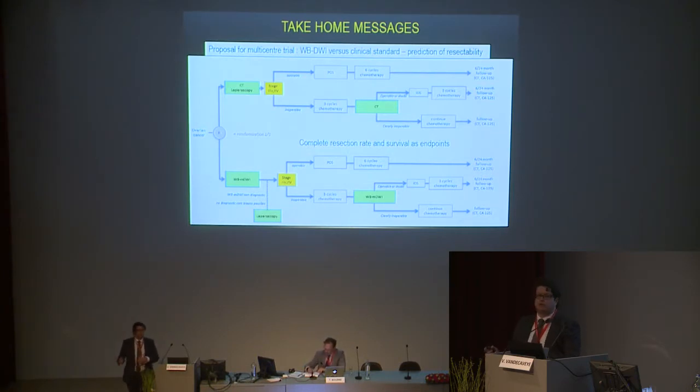But the Belgian government obliges us also to take into account overall survival, but I would doubt that we make a difference there. I think the most important is if we can improve or at least be, with a non-invasive technique, equally accurate to predict operability in these patients. I thank you for your attention.